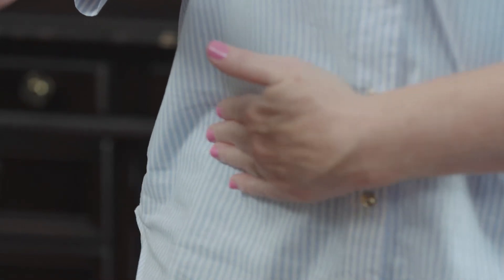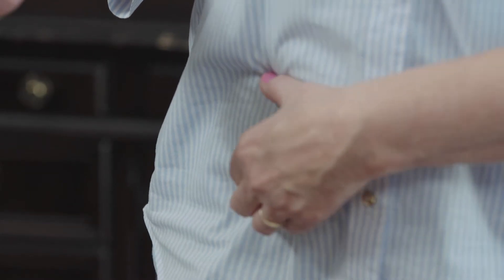To prepare your site you're just going to take your alcohol swab. The site is your abdomen or belly. You want to stay at least an inch away from your belly button — you don't want to get in there too close. Anywhere out here in the outer aspect of your abdomen around your waist, you can clean the area with the alcohol swab and then let the area dry.